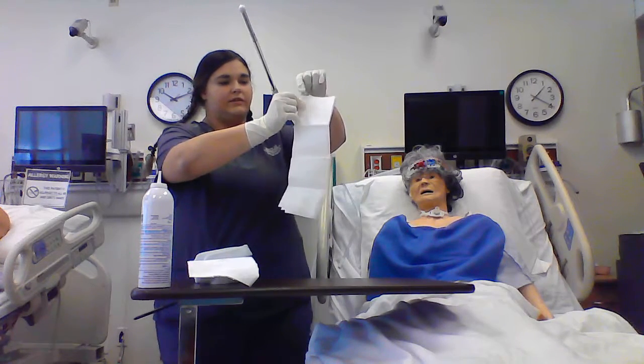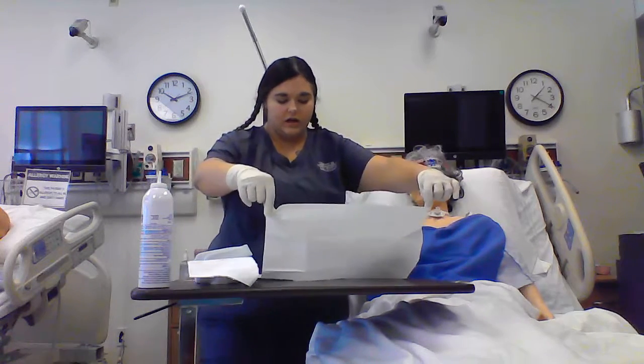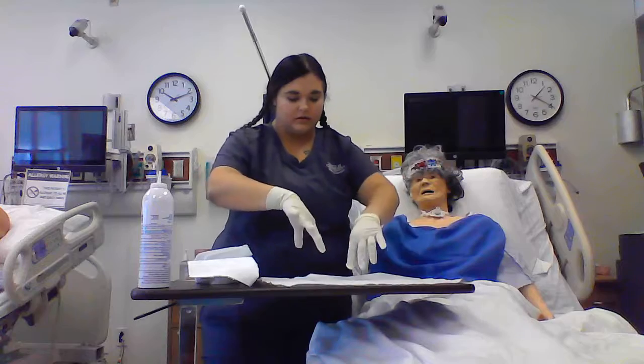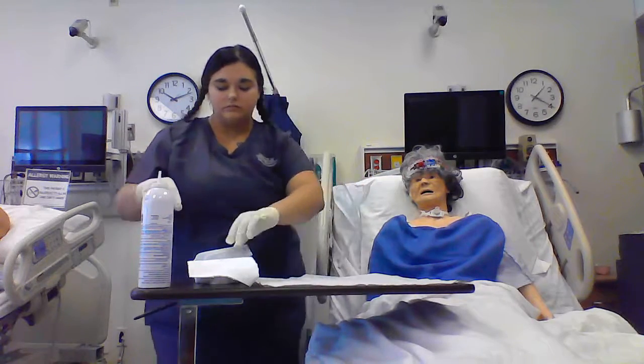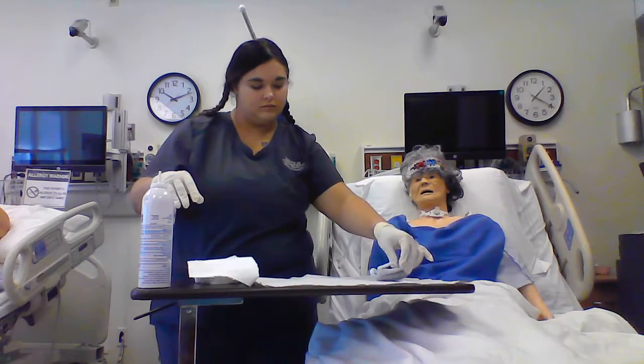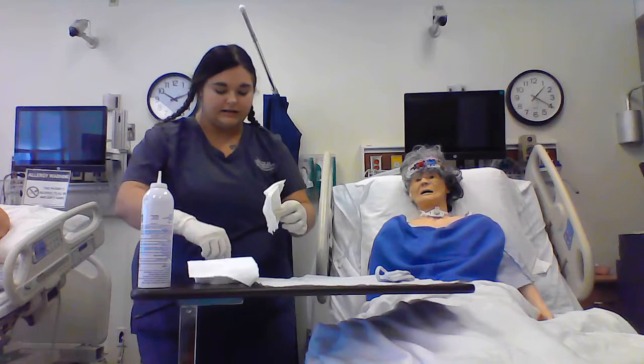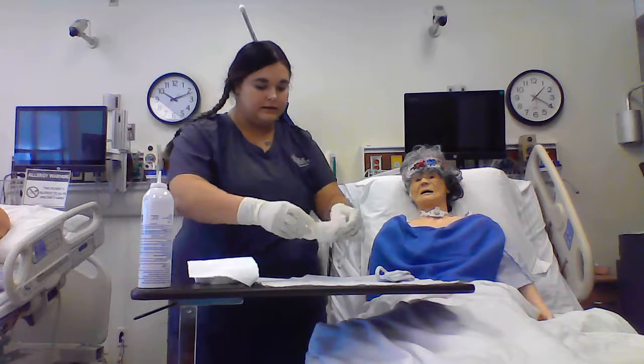When I set this sterile field up, I do want to keep in mind that I do have a 2-inch border around the sterile field that is considered non-sterile. And now I'm just setting up this sterile field.